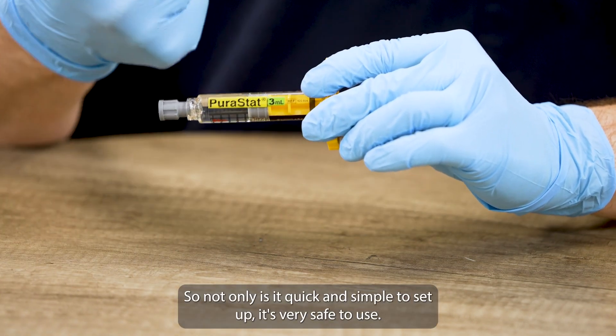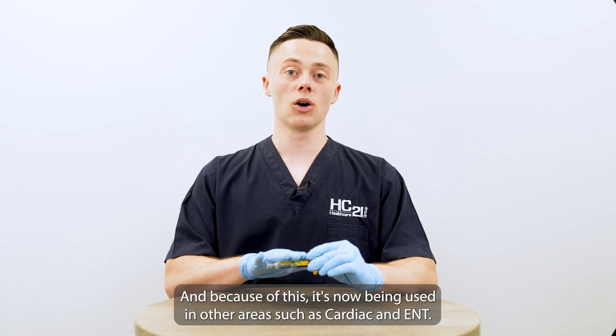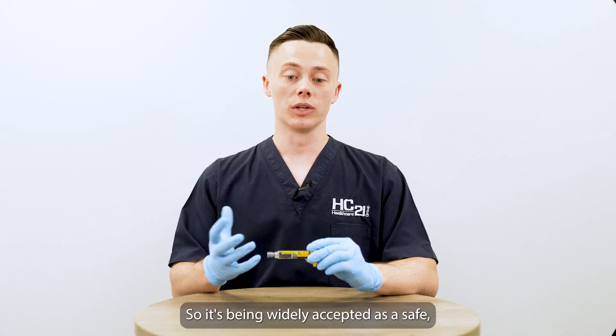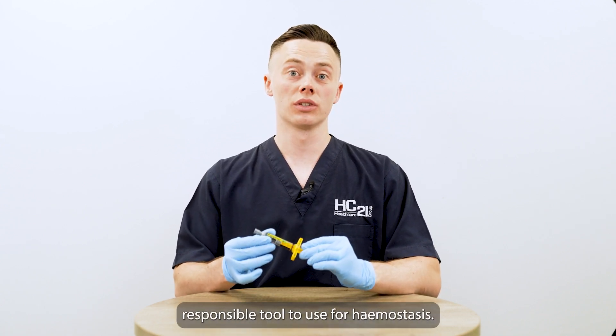Not only is it quick and simple to set up, it's very safe to use. And because of this, it's now being used in other areas such as cardiac and ENT. So it's being widely accepted as a safe, responsible tool to use for hemostasis.